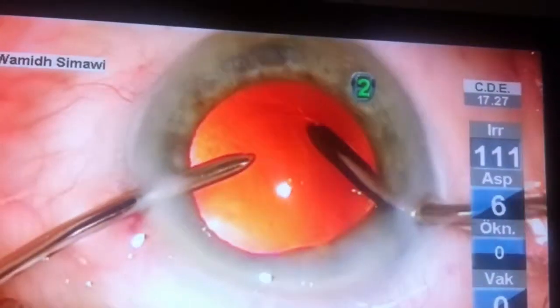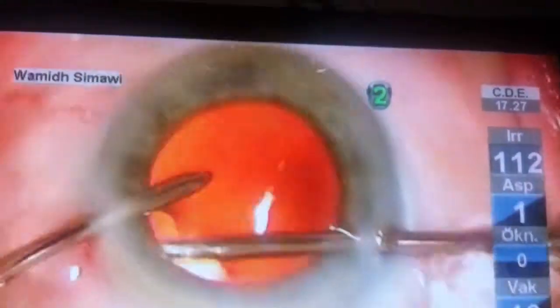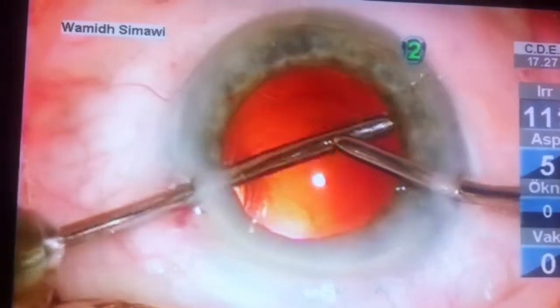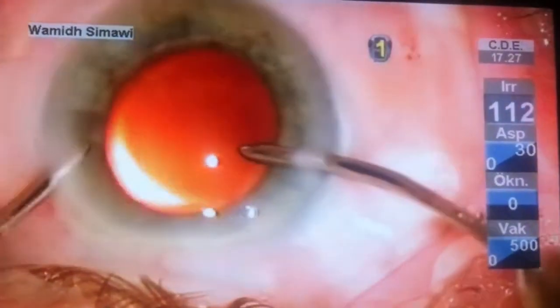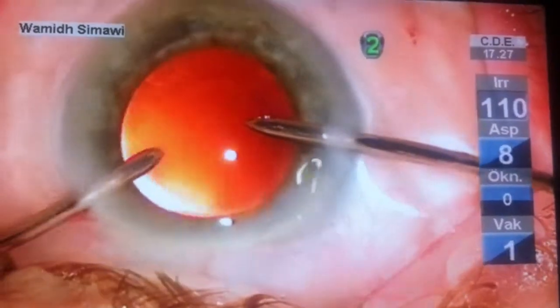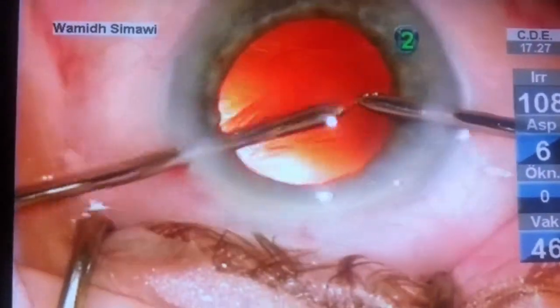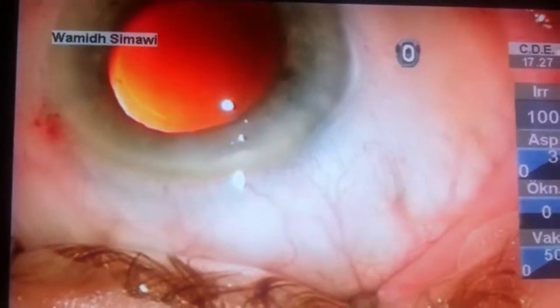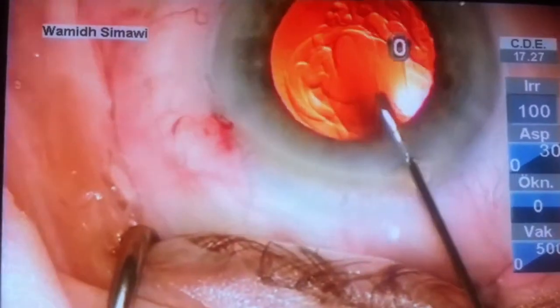Surgery must be done carefully and with respect to intraocular anatomy. Use gentle movements to the capsular bag to avoid iatrogenic zonular damage, especially in very old patients. Always review both paracenteses — we often catch small fragments there — so please be careful to collect all fragments meticulously, because less inflammation in the anterior chamber means less risk for postoperative macular edema.